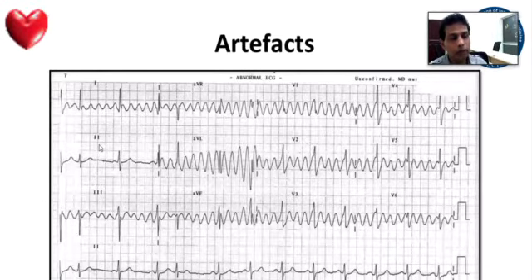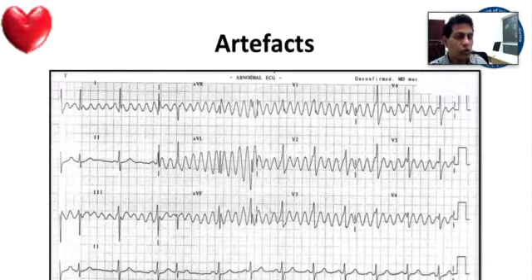But if you take an ECG strip, there will be about 40 or 50 QRS complexes. Now, if you look at V1, how come that L2 in the 4th row is normal and others are like VT? It can't happen because it's the same ECG complex.